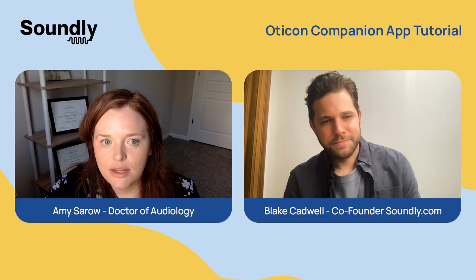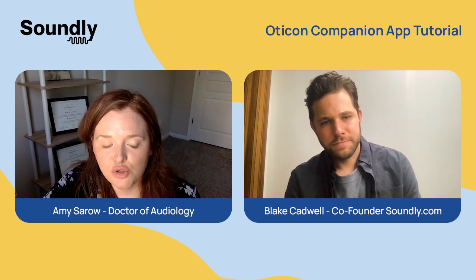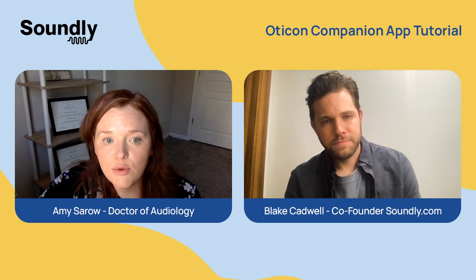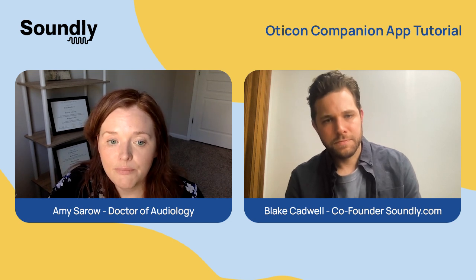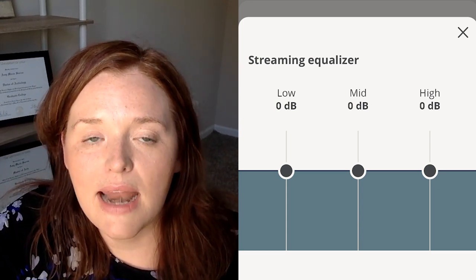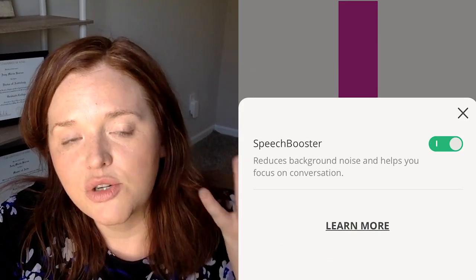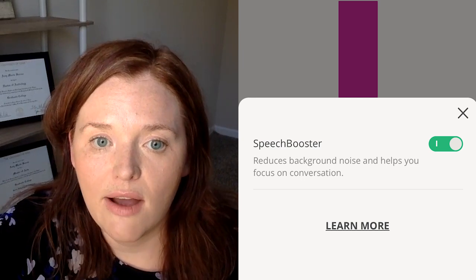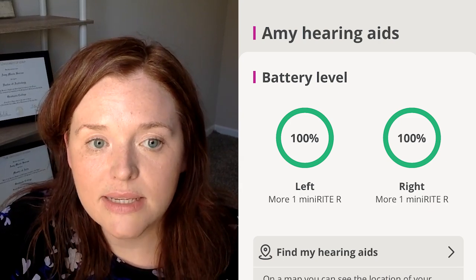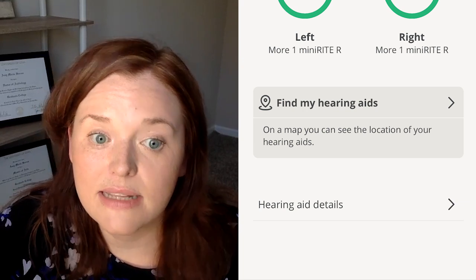So let's talk about some of the features. When you're in that main screen in the remote, you have the volume control — you can go up, you can go down with the volume, you can mute the hearing aids, and you can split them apart and adjust volume separately. You also have streaming sound equalizing, so you can adjust low, mid, and high frequencies. There's a speech booster feature — if you need a little extra boost with speech understanding, you can turn that on. You can check your battery levels, which will tell you what percentage your battery is at for left and right. And on that screen you also see the find my hearing aids, so if you did lose your hearing aids, that's how you would track them.